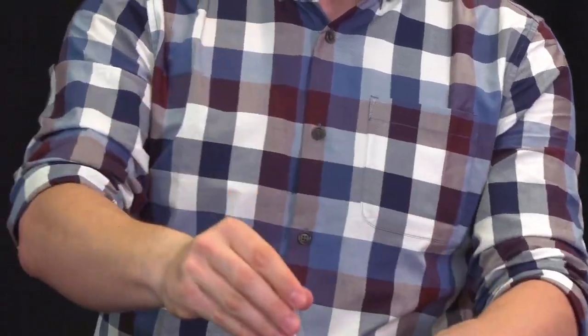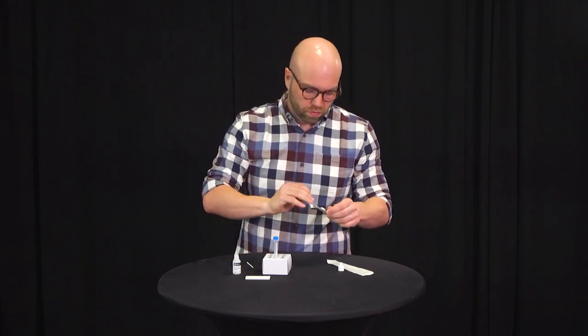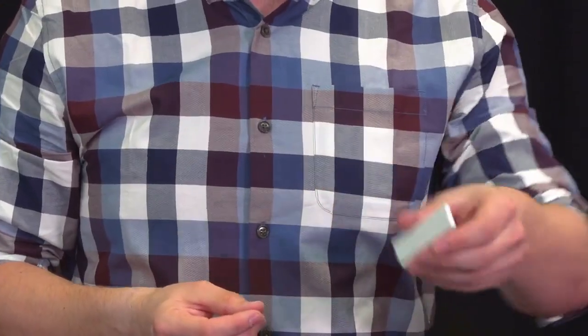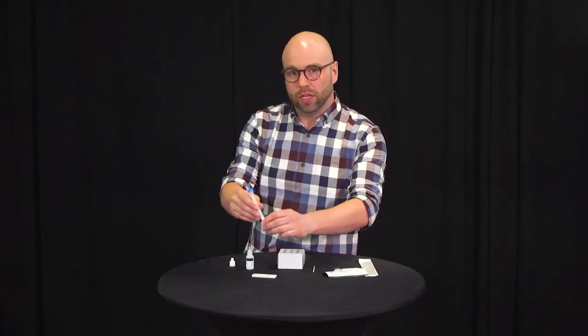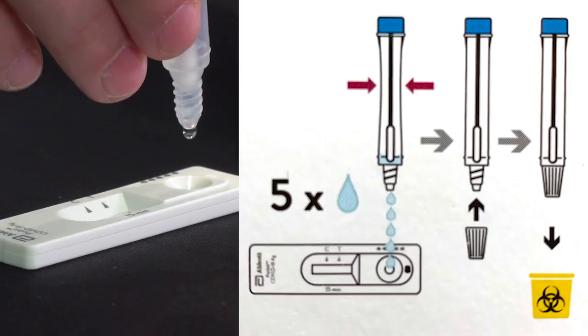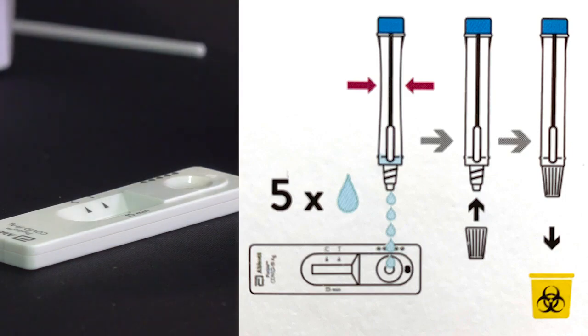The test administrator will then tear open the test pack, remove the pad, and put the name and employee number on the back of the pad. It is critical that you know who is doing the test. You will notice that there are two spots on the test — the longer one is where the result will be, and the other is a small hole where you will drop the fluid to start the test process. Take your vial, unscrew the bottom, and drop only five drops into the test side right into the middle.